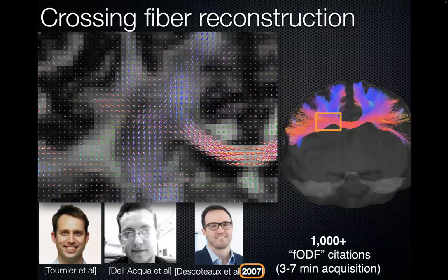But nowadays, this notion of crossing fiber modeling, no matter what tool you use, whether spherical deconvolution or multi-tensor fitting or whatnot, the essential here is that it's critical to acquire good images, but also to reconstruct the multi-orientational features of the signal at every voxel. And this is not necessarily for free. It doesn't come for free, right? DTI was on the order of 3 minutes. Today, we're on the order of 5 to 10 minutes, so you need a bit more data.